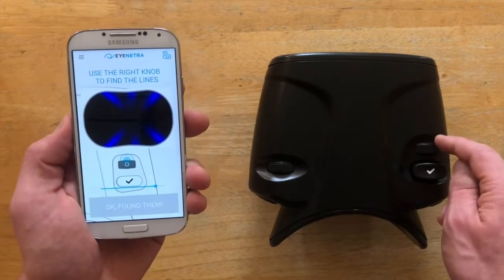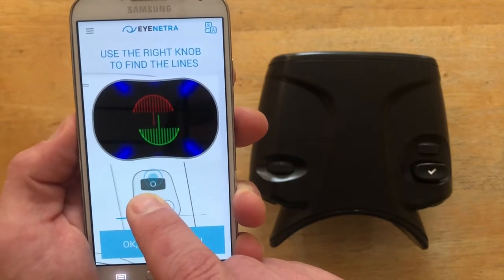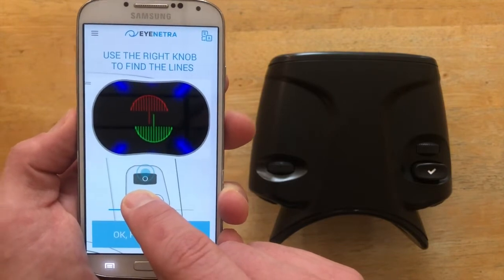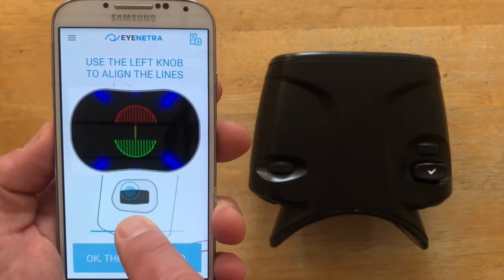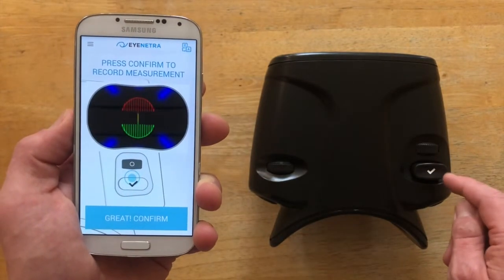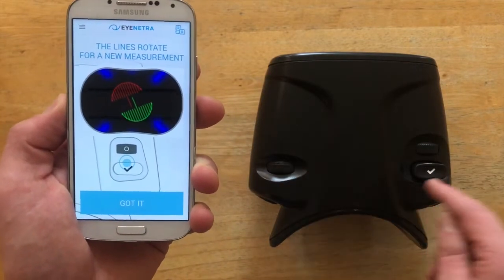Step one: using the right knob, we're going to move that knob back and forth until we find those red and green umbrella-like shapes so that they appear equally visible in the center of your vision. I'm using the slider on the screen as a proxy for the knobs on the device itself. Step two: we'll use the left knob to simply align the stems or handles of the umbrellas until they overlap. And then once they're aligned, we will click the confirm button to confirm. Each time the patient clicks, the umbrellas will rotate and they will simply repeat the same three steps again: find with the right, align with the left, and click to confirm.